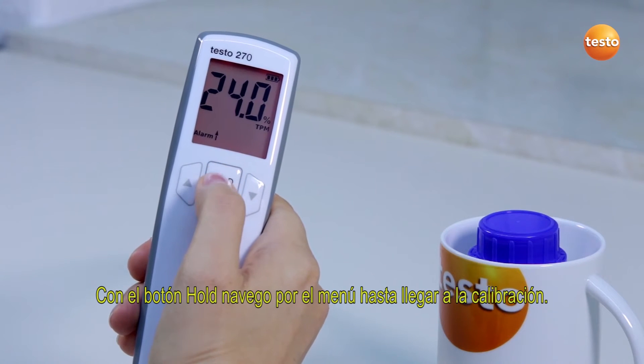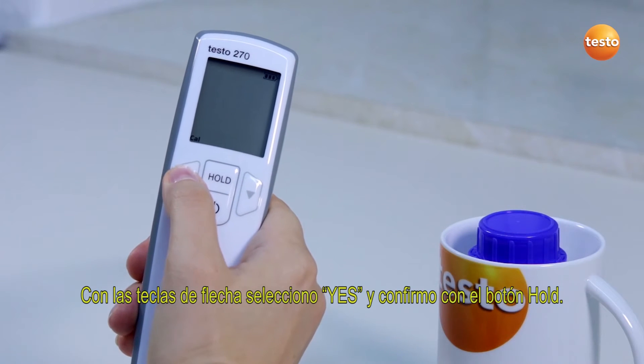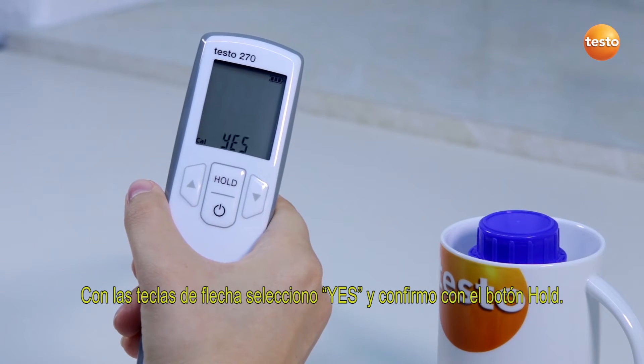Using the hold button, I navigate through the menu to calibration. With the arrow buttons, I select yes and confirm with the hold button.